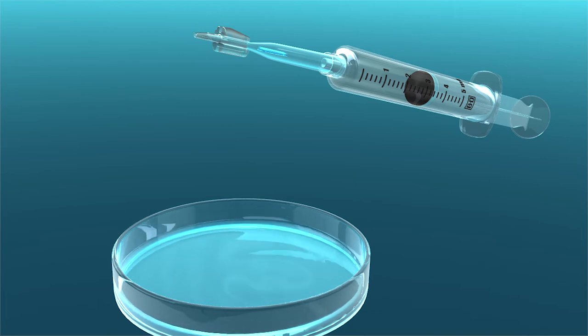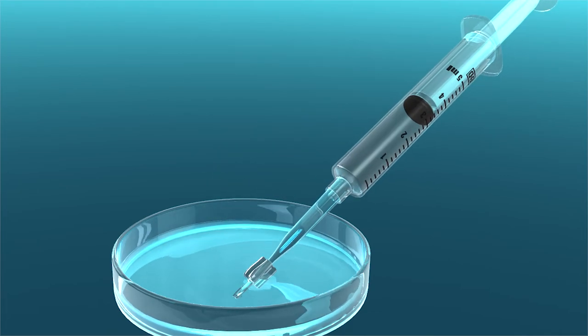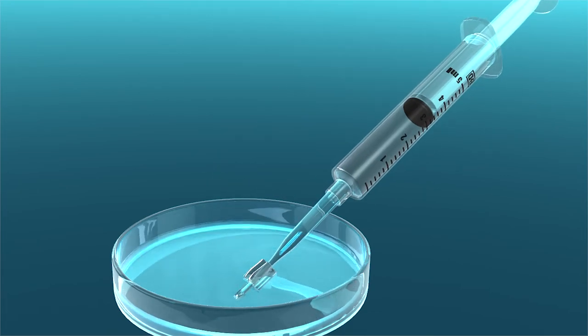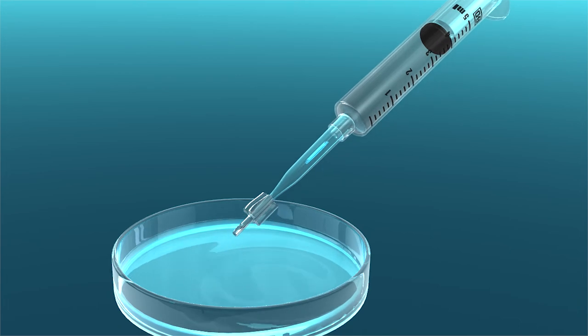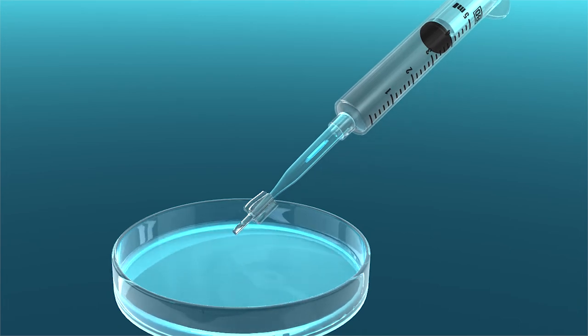If the graft starts to enter the slender end of the cannula, aspirate BSS from the petri dish to reposition the graft while continuing to flush the corneal storage media from the cannula. Do not allow the graft to enter the slender end of the cannula during this process.